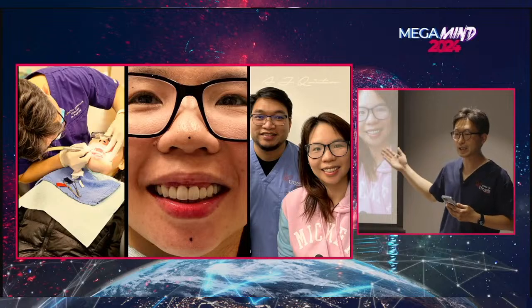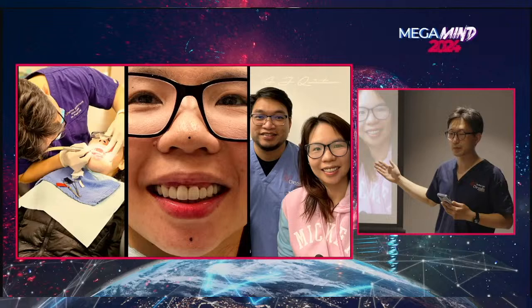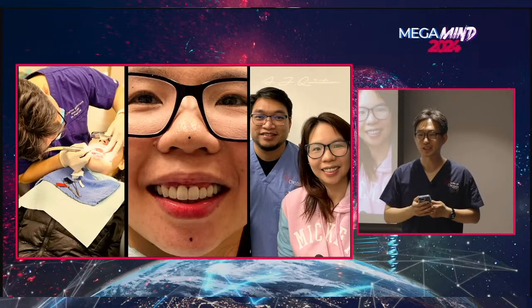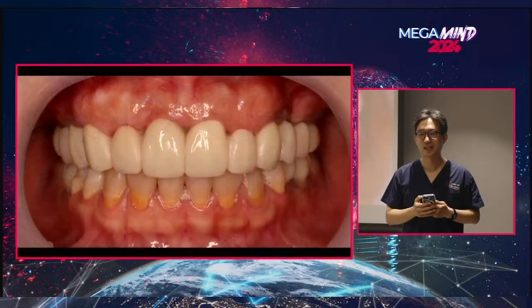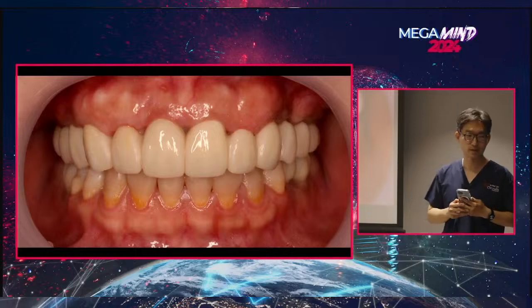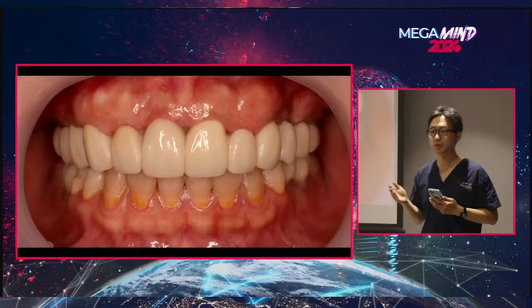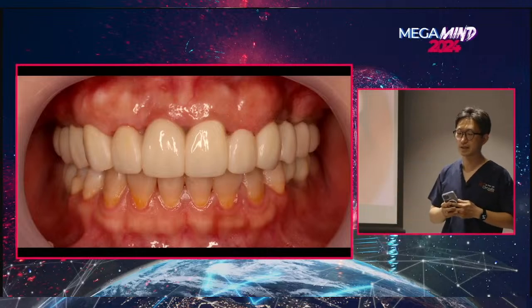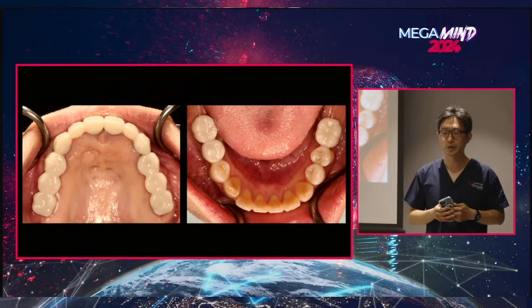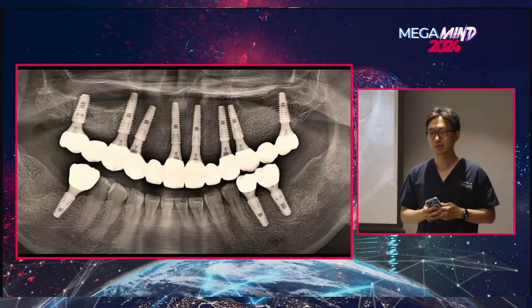And our CAD/CAM master, AJ Quintero, who designed and fabricated the final prosthetic, came to celebrate the glorious day with us. And the final intraoral photo. And look at that natural gingival contour that we were able to preserve. Final intraoral photos from occlusal view and the panoramic image showing impressive result.